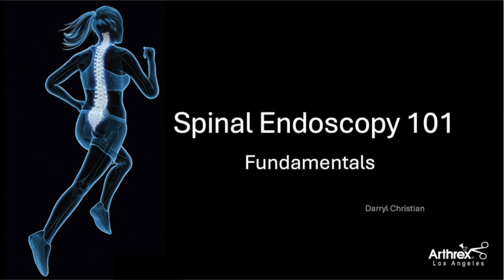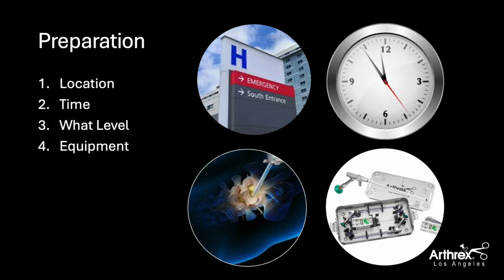So you get your first case. You get a call from a rep or myself. And at this first case, the first thing that you need to know is you want to make sure that you identify different parameters of the case so you're well prepared. First of all is location. Then after the location, you're going to be able to set up when you need to bring it there as far as SPD, as well as equipment needed, surgeon preferences, and those things. I think it's important, that location.